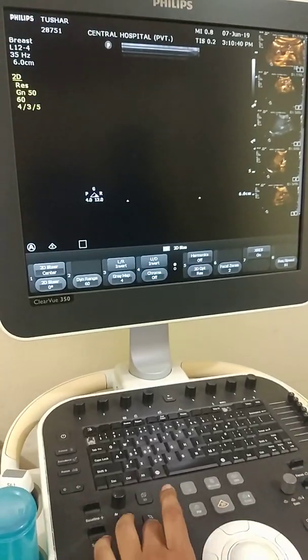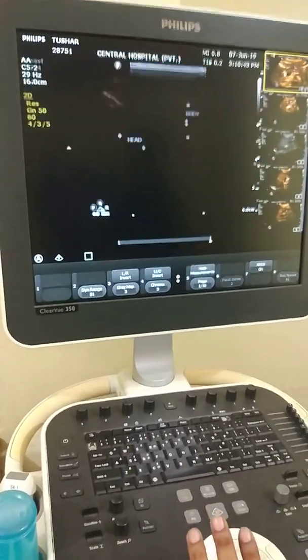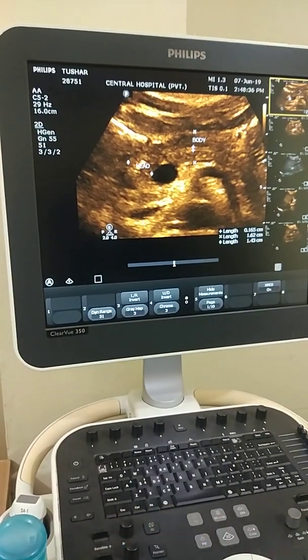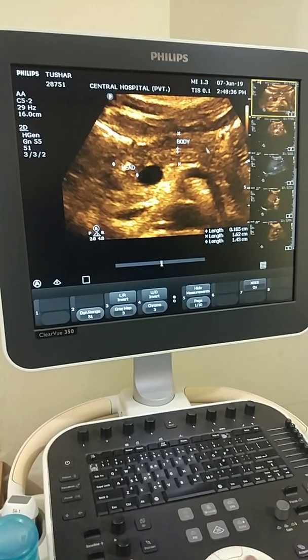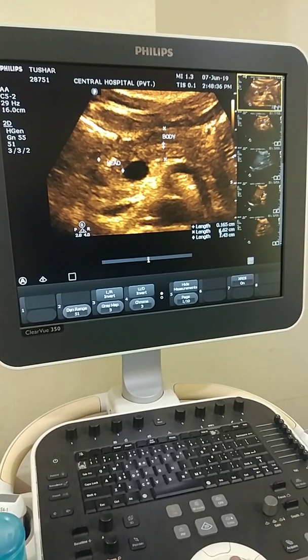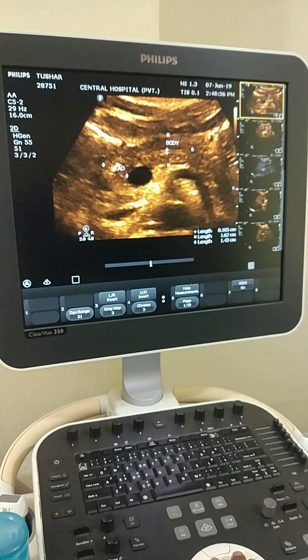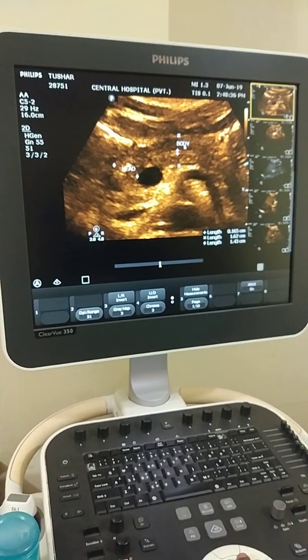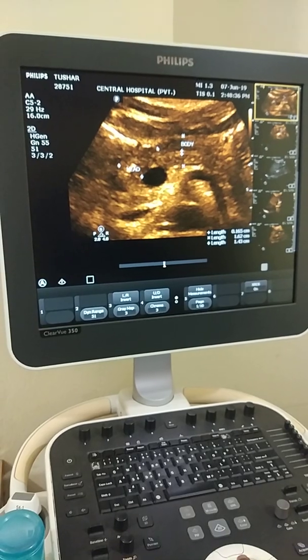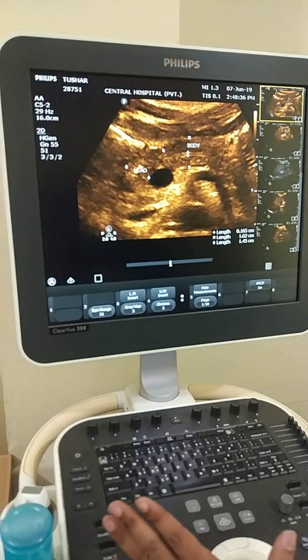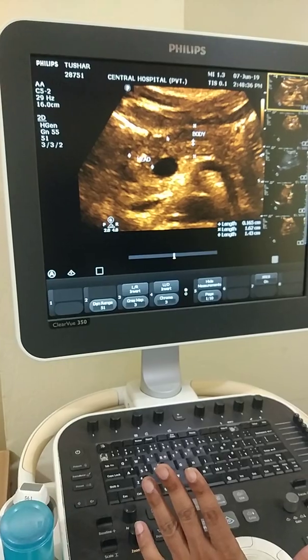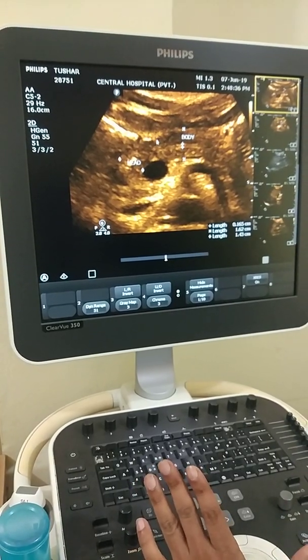I scanned the pancreas, which shows almost normal — something slightly hypoechoic, but the dimensions are almost normal. There are no calcifications, which would be suggestive of chronic pancreatitis. So I concluded that this is a normal pancreas.